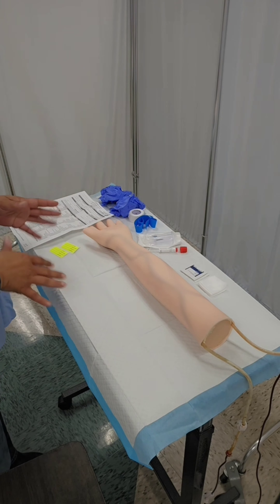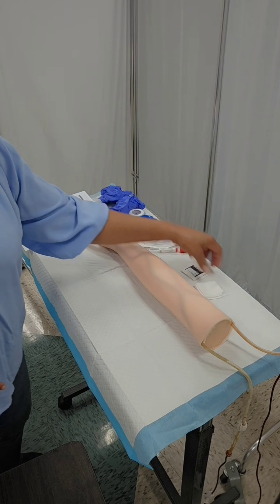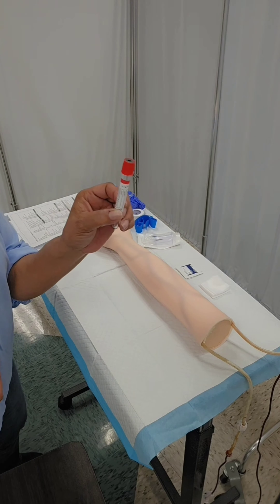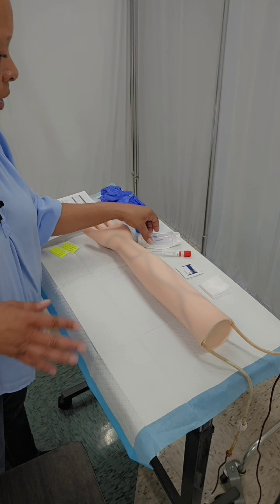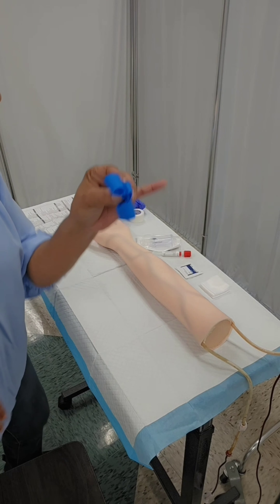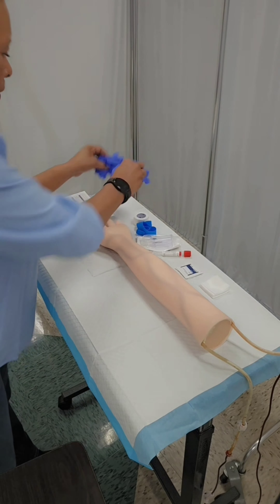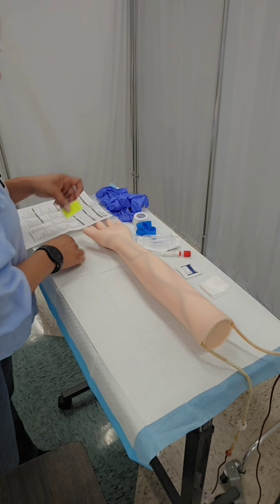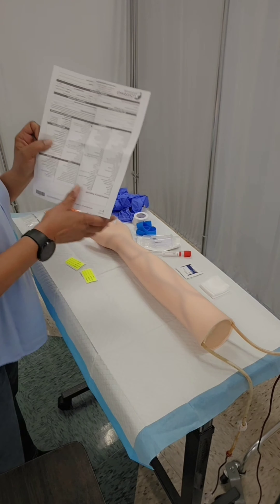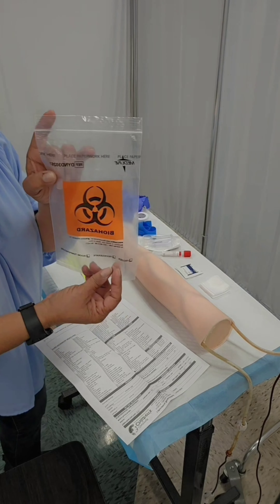I have all of my supplies on the table. I have a couple of two-by-twos, a couple of alcohol pads, the red top vacutainer tube, my vacutainer with needle, my tourniquet, paper tape, two pairs of gloves, two labels, my requisition form, and my specimen bio bag.